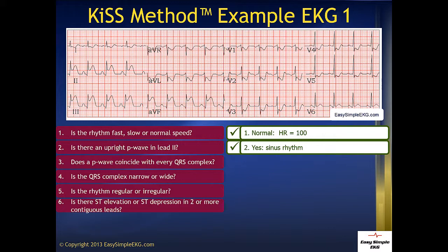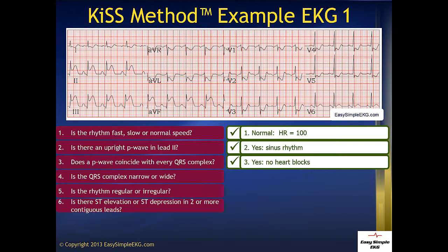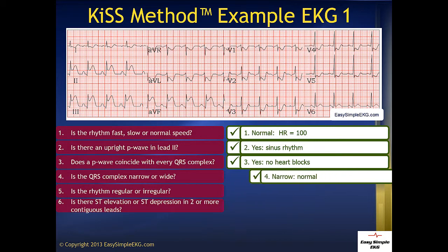Does a P wave coincide with every QRS complex? And it does — this is also normal. This means our patient is not in a heart block. Is the QRS complex narrow or wide? It is narrow, which is normal. This means the energy is moving through the heart in the normal electrical conduction pathway.